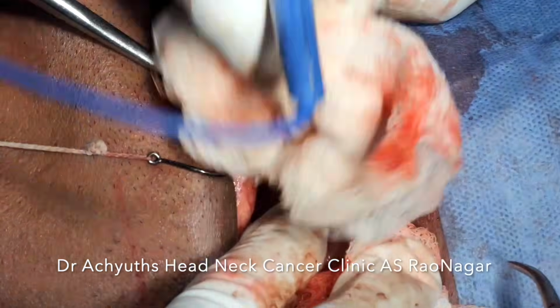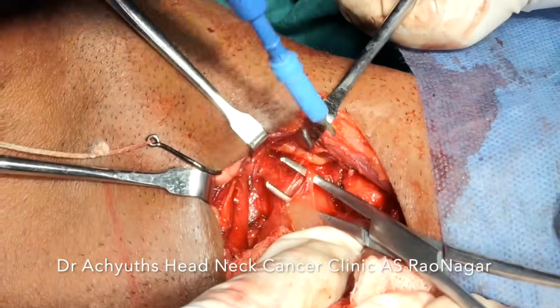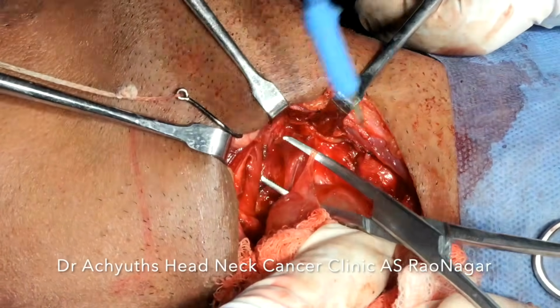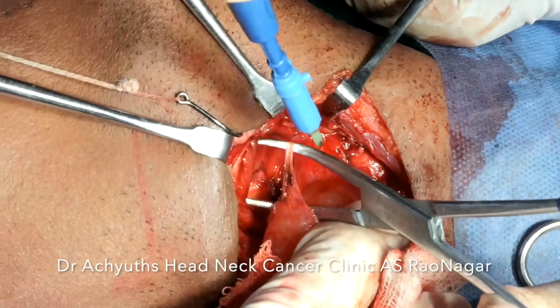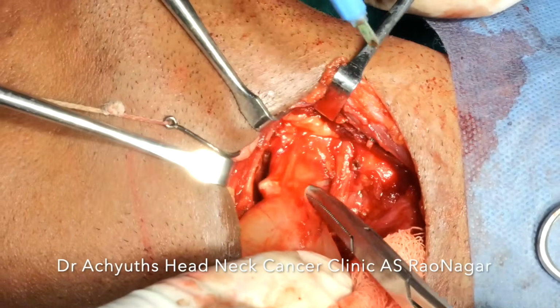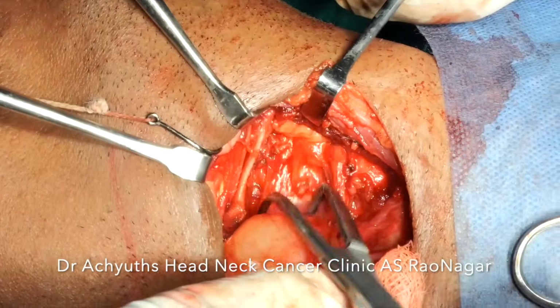After division, we can actually see the intact mucosa and the epiglottis as well. So inferiorly we see the thyroid cartilage, the epiglottis, and superiorly we see the hyoid bone. So gradually we are dissecting it out, and fortunately in this case, without damaging the cyst wall anywhere during the surgery, we could get away excising the cyst entirely.